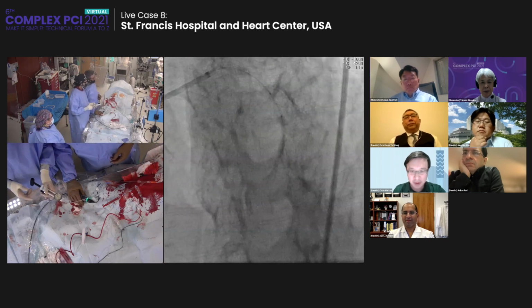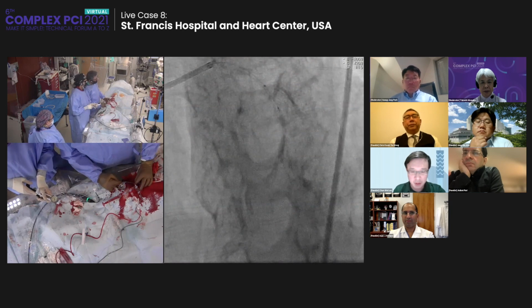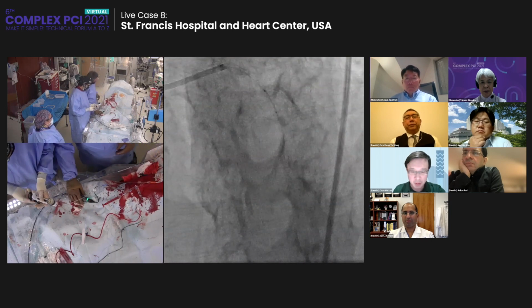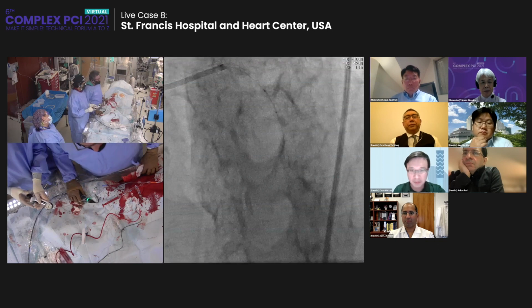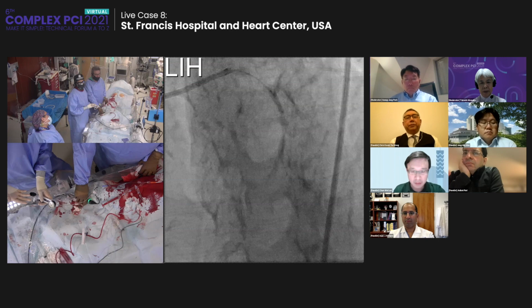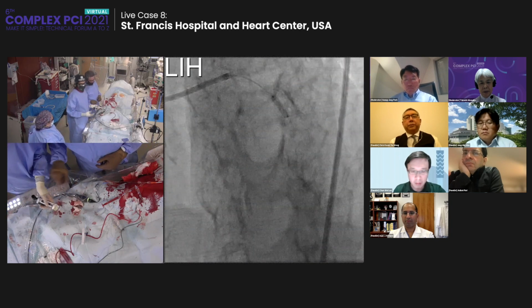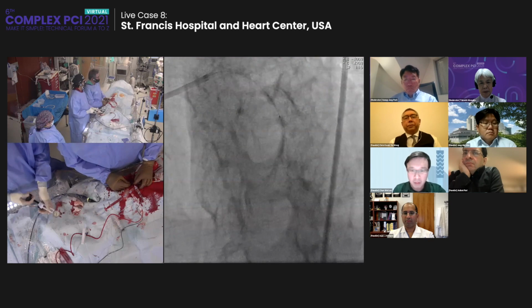Okay, so Rich is going to show you pulse management some more. So going to come back a little bit here and try to straddle this lesion, but I feel very comfortable that we're going to have a very good picture here. Now, again, remember, it's not probably worth it to go to 6 atmospheres and risk popping your balloon, because if you add the atmospheric pressure that comes from the acoustic bubble, the difference is 54 versus 56. So that 2 atmospheres is probably not going to give you a lot of benefit.